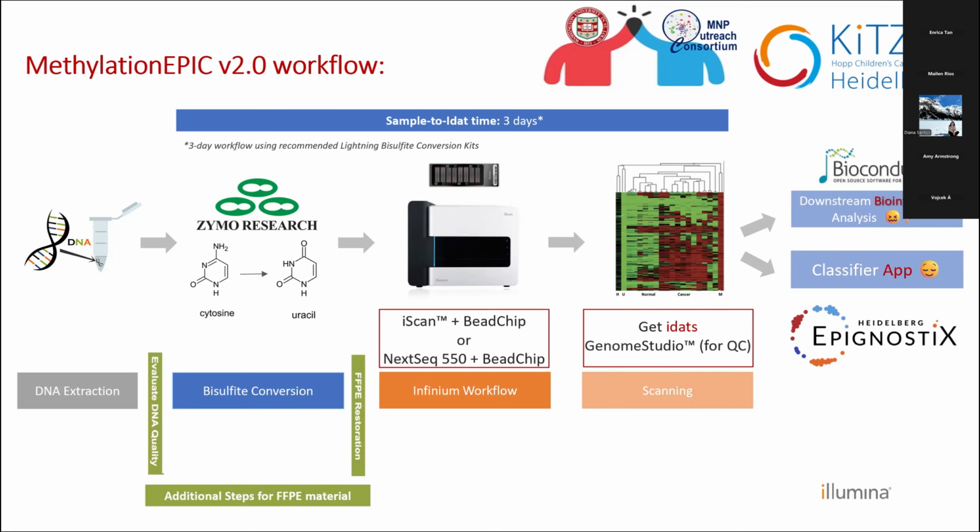But for the workflow in the lab, if you're conducting methylation in a high throughput institution like Heidelberg, for example, then it would really be only the 5 days or the 3 days. Felipe and I were at a meeting in Brazil a couple of weeks ago, and there was a talk from MD Anderson about real-time methylation in the OR. So it seems this is pretty doable because you're basically cutting the time from 3 to 5 days to within a short period of time. In my mind, I thought it has to take a very long time and so on, but it seems it can be done.